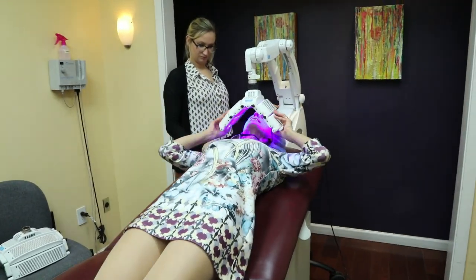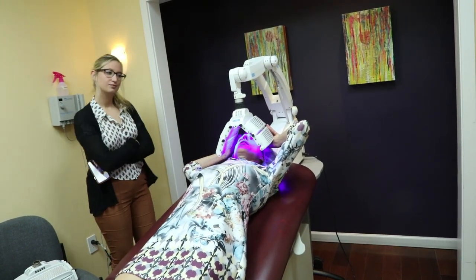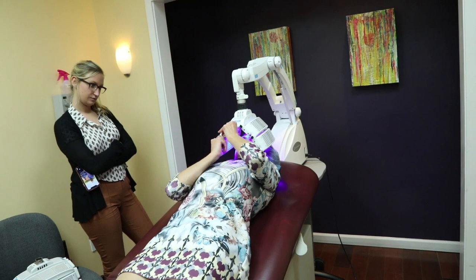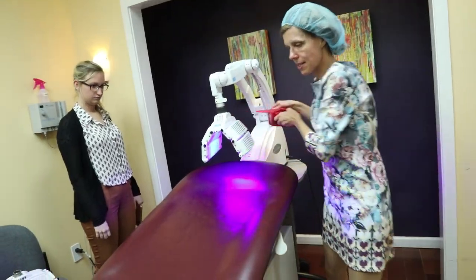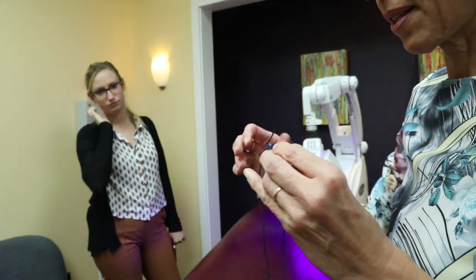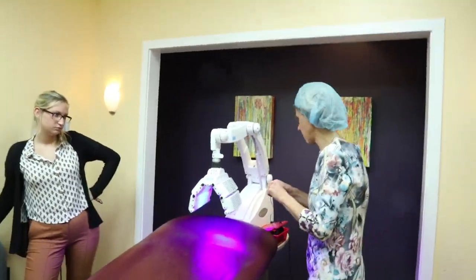Before you actually activate it, you want to equip the patient with goggles. Establish the position first, because you have your goggles here. You want to assure that the patient wears these really, really dark goggles — they don't allow any light to go through. They're totally black, allowing the light not to reflect. This is more important for the red light. Apply the goggles before you activate.